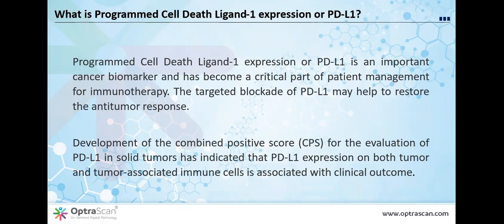So part of the goal of the Optra PD-L1 process is that it will help us speed up the process and get accurate and efficient results.